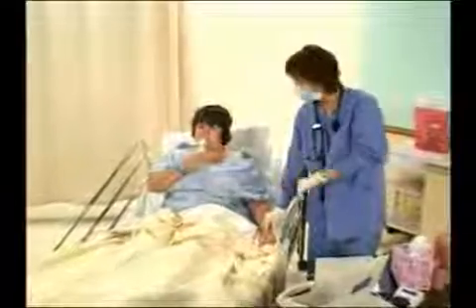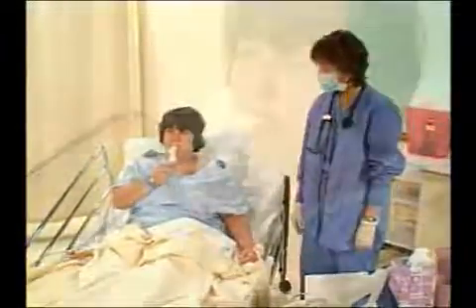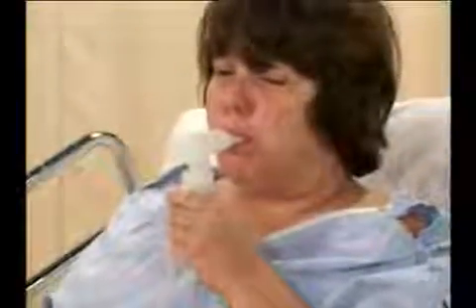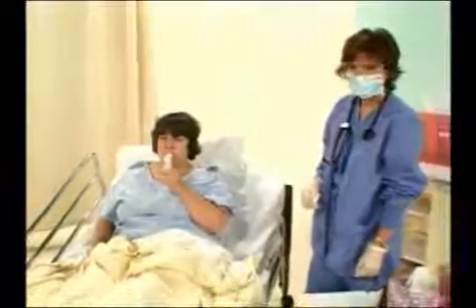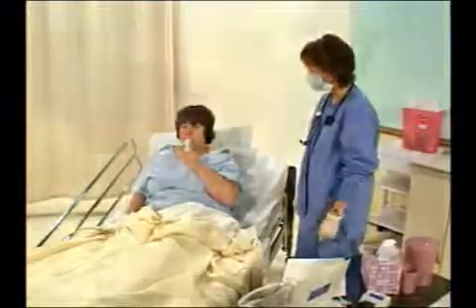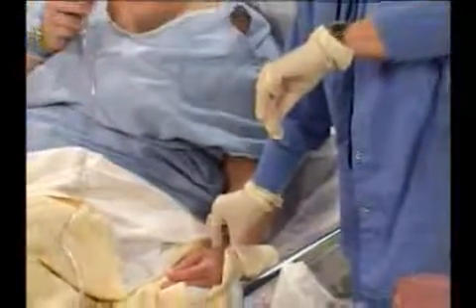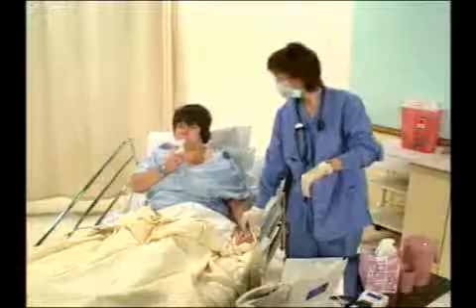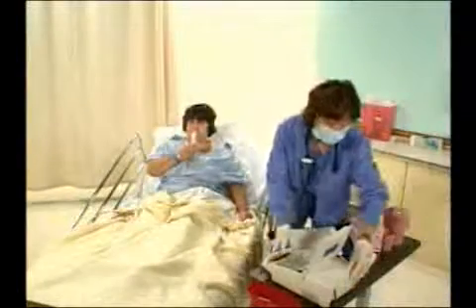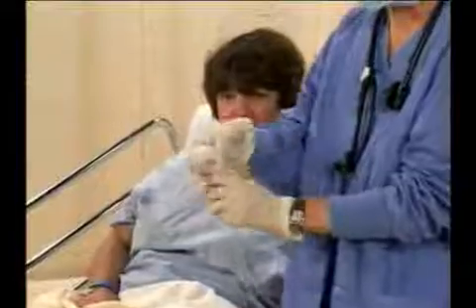Instruct the client to breathe in and out slowly and deeply through the mouthpiece or mask. The client's lips should be sealed tightly around the mouthpiece. Remain with the client long enough to observe the proper inhalation-exhalation technique. Also, observe the client for any side effects or distress while the medication is being administered. When the nebulizer cup is empty, turn off the compressor or wall air to stop the aerosolization.